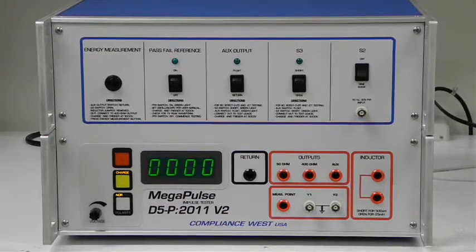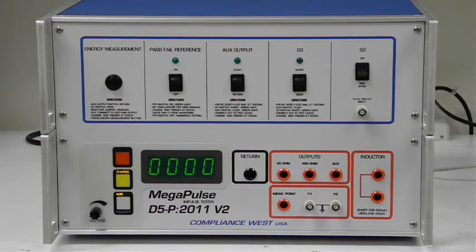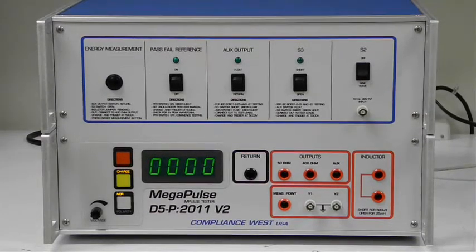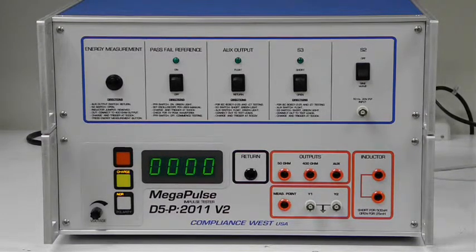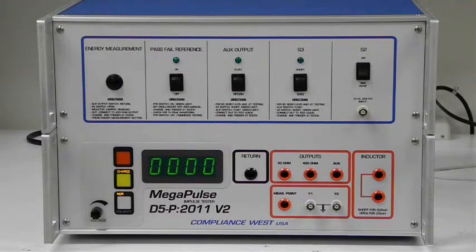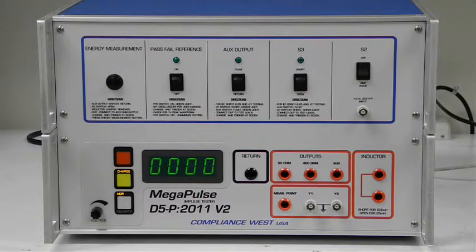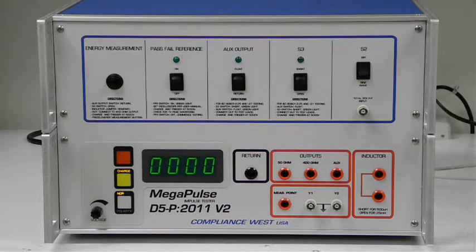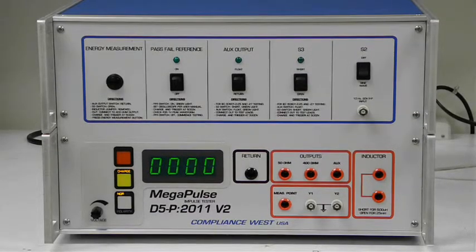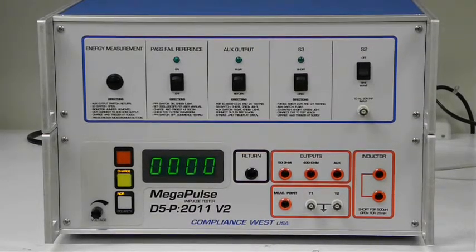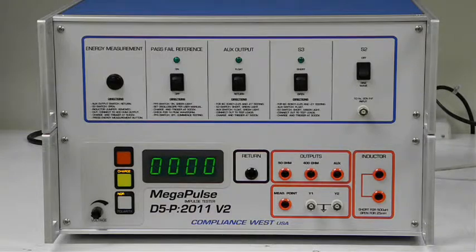The test sequence is to conduct the test with the patient connected or applied part connected, then remove the part and conduct the test on the 100 ohm resistor alone.